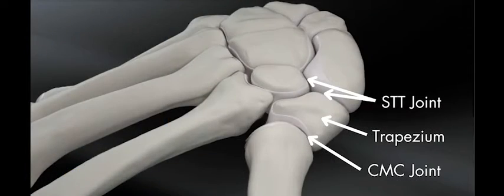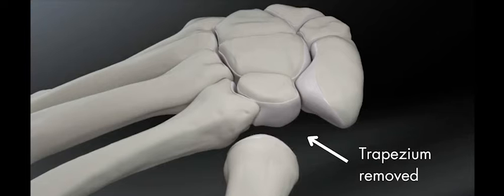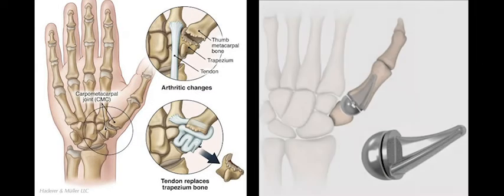There are several accepted surgical techniques for thumb CMC joint arthritis. All procedures involve partial or complete excision of the rectangular bone at the base of the thumb called the trapezium. This solves for the mechanical bone-on-bone pain between the metacarpal and the trapezium. Some surgeons harvest a tendon graft to be implanted in this space, while others prefer placement of a stemmed implant, similar to what is used for shoulder and hip surgeries.